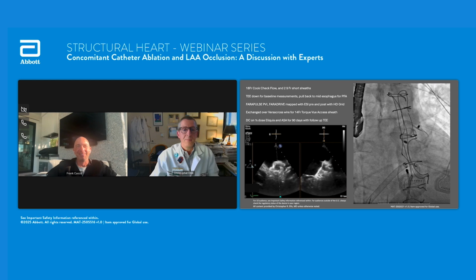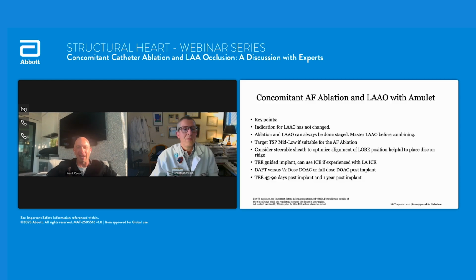I think that was back when we had much less accurate tools and less experience with ICE. Now, crossing back over the septum, I agree, and I do echo your sentiments, Chris. I've only had two devices acutely dislodged in my career. One was very early, and it was due to some very poor imaging and probably a bad decision to release the device. The second one was a patient who we did an AV node ablation on after we did the left atrial appendage closure, and the patient had a very stable device position.